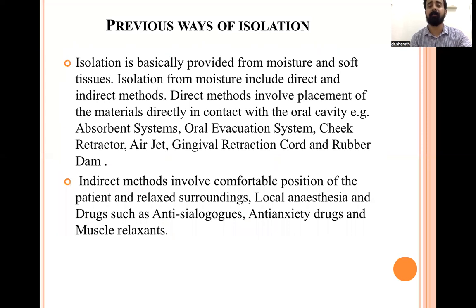The previous basis of isolation was basically by means of absorbent system, oral evacuation system, and cheek retractor system.